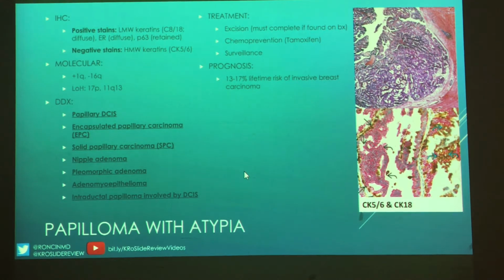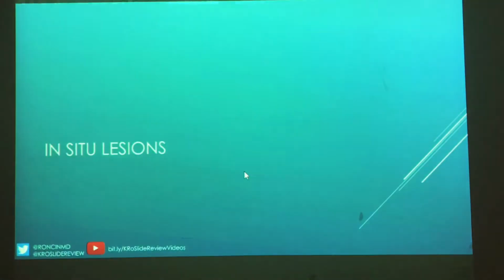Okay. And all this information, again, is the ADH information, because ADH itself has increased risks anyway. Okay, but the pictures are all papillomas, so you can appreciate that. All right, in situ lesions.